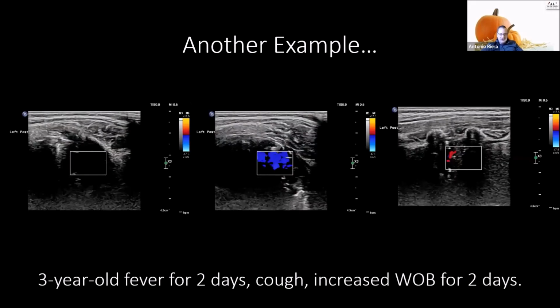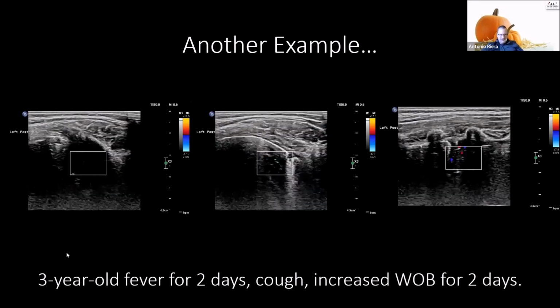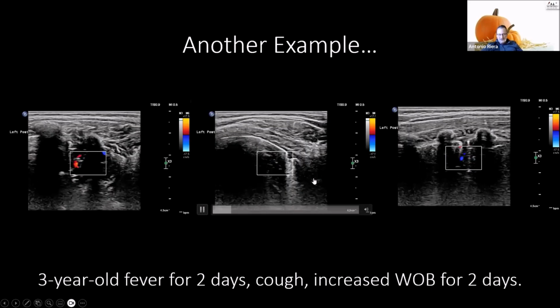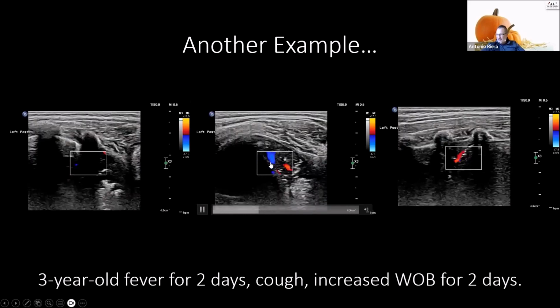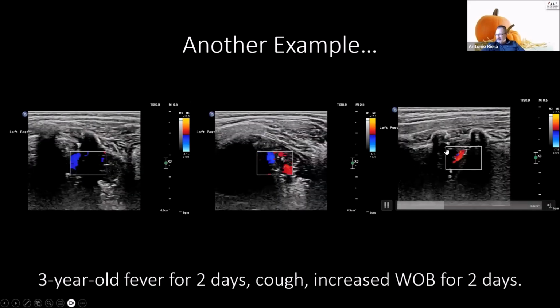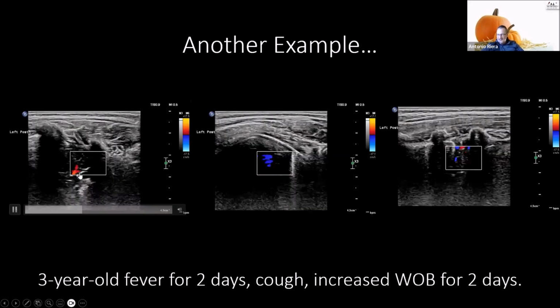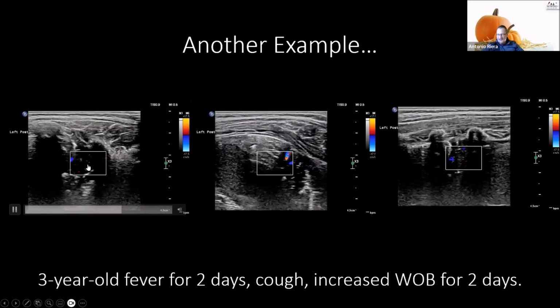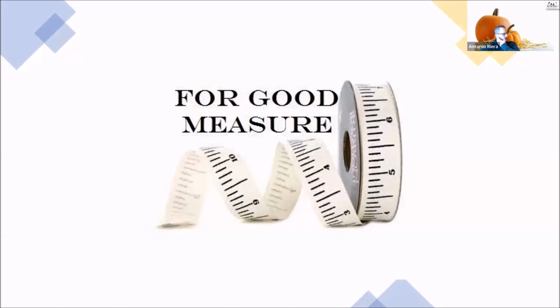This one was, I think, trickier because this kid was younger, the lesion was smaller, and it was a toddler with some sort of tachypneic exam. So it was harder to get a sense: is that artifact from breathing? And I try to make the box really small, as opposed to here, where I think I'm seeing more inflammatory hyperemic changes within the box. Whereas here, the blue, I think, is artifact, and maybe the red is more real. This young girl ended up being admitted for O2 requirement, and the floor team checked the procalcitonin that was elevated, and they completed the course for pneumonia.